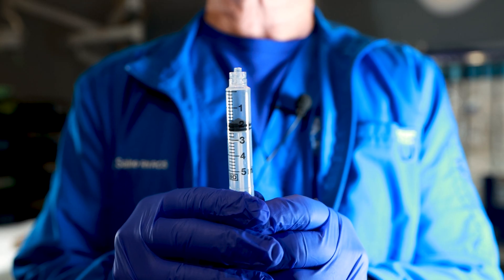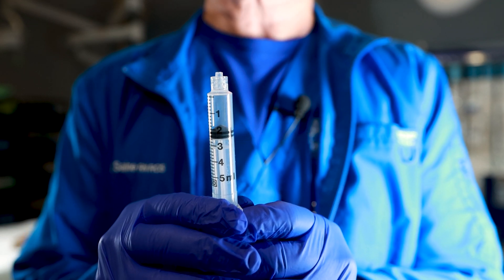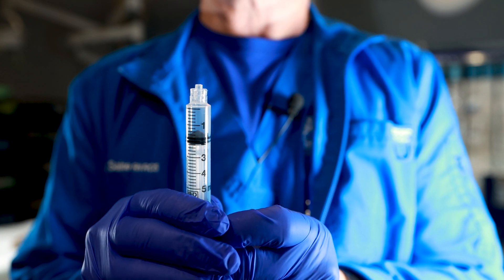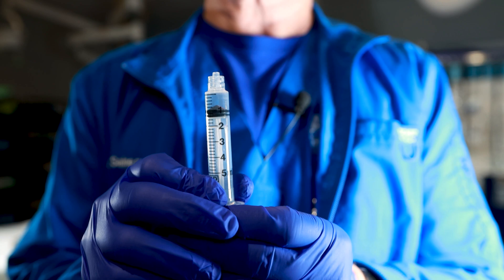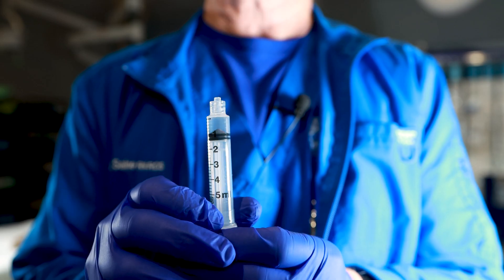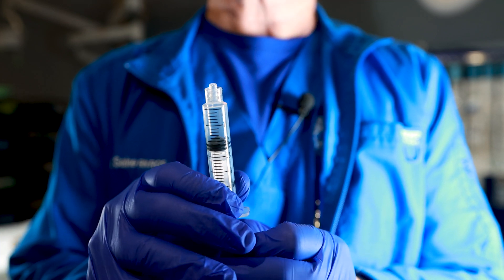So the plunger is lined up on the two cc mark. I can show you — if it was going to be three cc's, the plunger should be at the top part of the plunger marker. This would be relatively easy to give one cc of medication. But if I give half a cc that's a little more challenging, and a quarter of a cc is even more challenging.